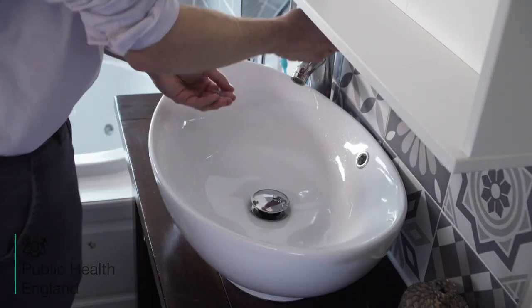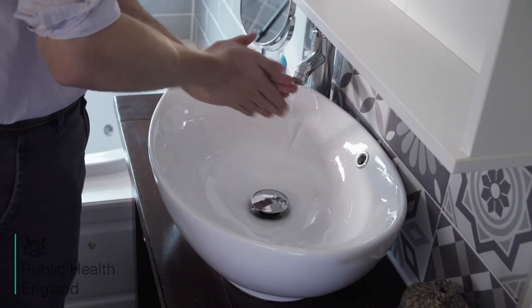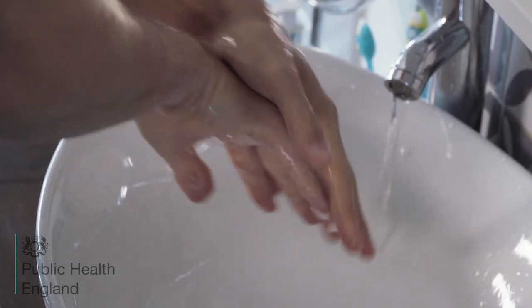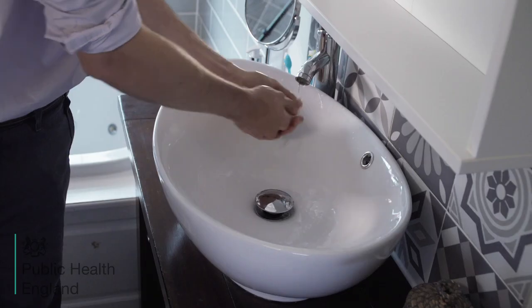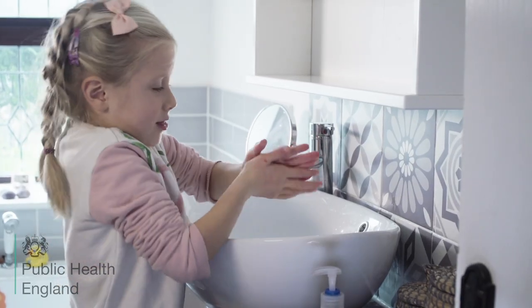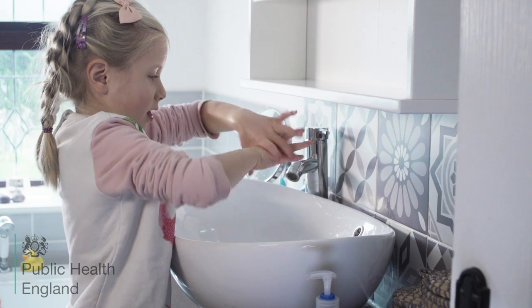Now wash your hands. Please help older children who have taken their own swab to wash their hands, as shown.